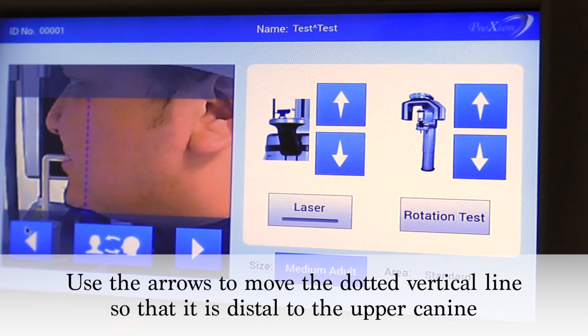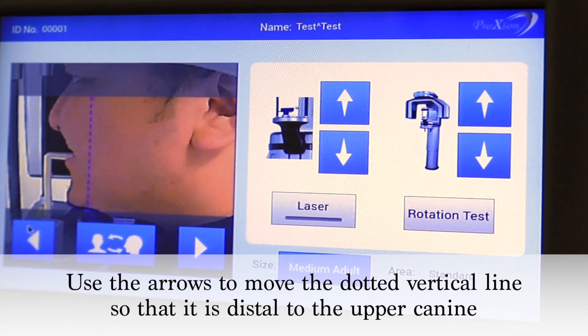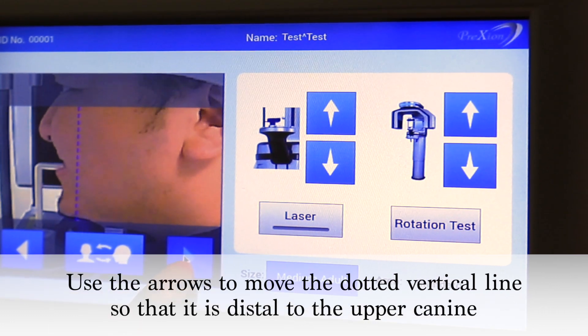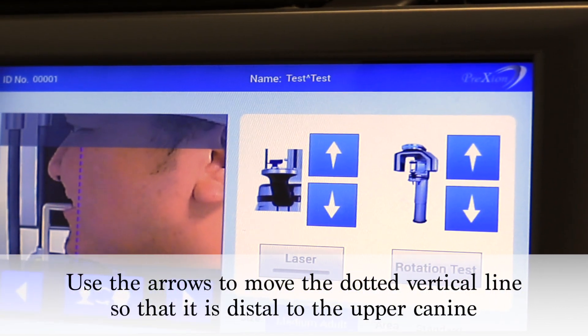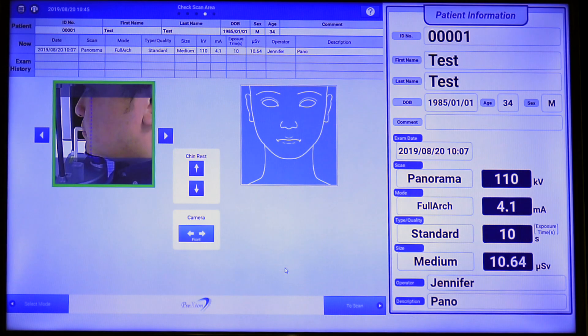The arrows on the lower left of the small console screen can be used to properly position the focal point. Once properly positioned, click to scan.